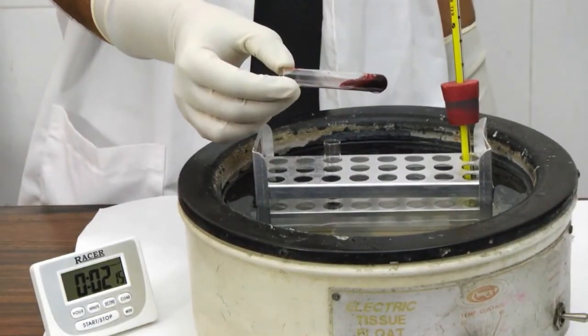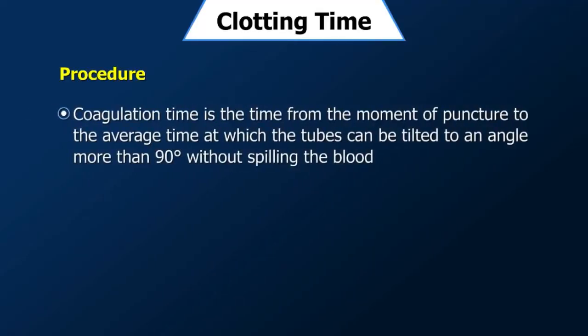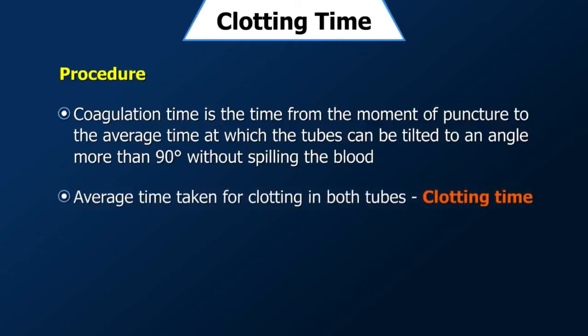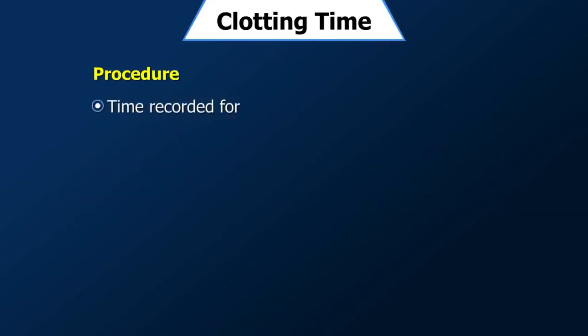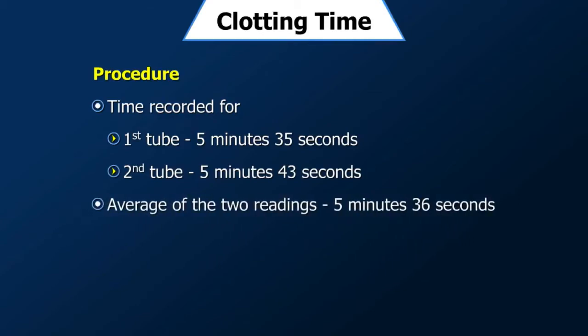Check the clotting in both tubes every 30 seconds. Coagulation time is the time from the moment of puncture to the average time at which the tubes can be tilted to an angle more than 90 degrees without spilling the blood. When blood clots in both tubes, take the average time for clotting — this is the clotting time. For this demonstration, the time recorded for the first tube is 5 minutes 35 seconds and for the second tube is 5 minutes 43 seconds. Therefore, the clotting time is the average of the two readings.